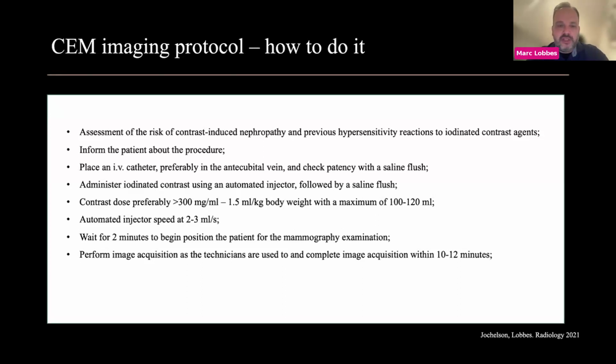So it's much easier for your everyday practice to just perform your mammographic positioning in the way you're always used to. When you change the order of image acquisition, your technicians become a little bit anxious. They become stressed. They are afraid that they cannot finish within the 10 to 12 minutes that they need to work within.